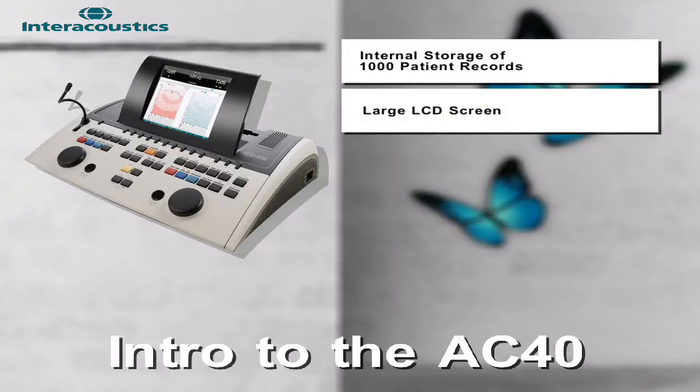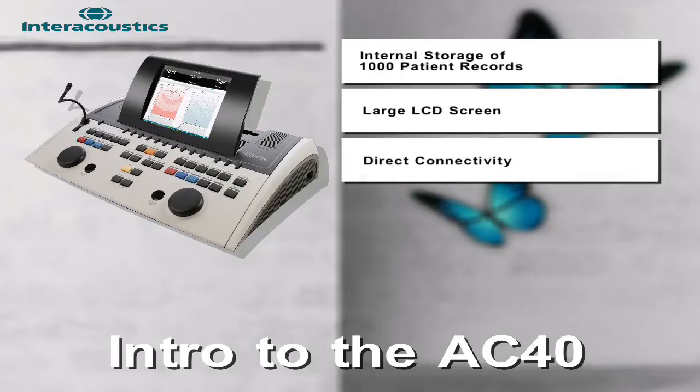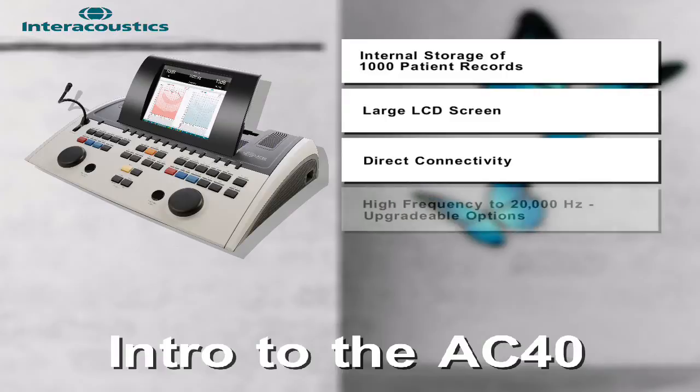For increased flexibility, direct connectivity to external devices such as a printer and PC keyboard allows for increased performance. Lastly, high-frequency testing is an upgradeable option to meet the testing demands of any facility.